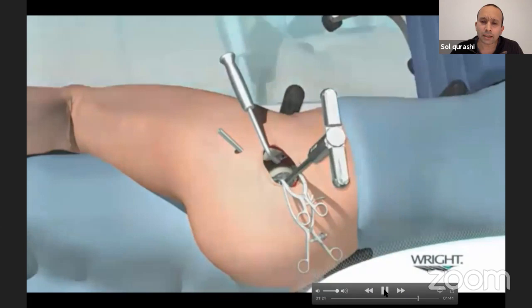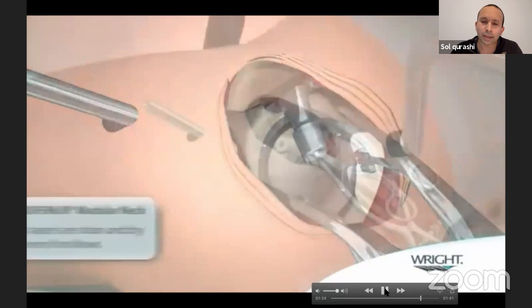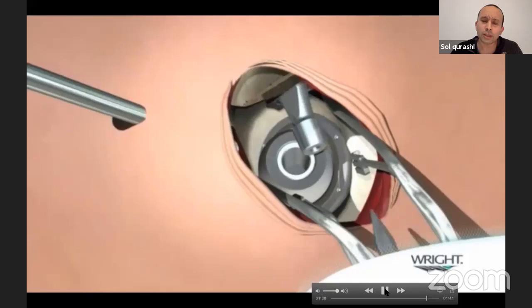You've impacted the cup in. Once you do that, then I do the trial. So the neck of the femoral trial goes into the broach. We put in the trial liner into the cup, and then the head goes in, and then we do what's called an in situ reduction. That is putting the head in, then trying to relocate the neck into the head.